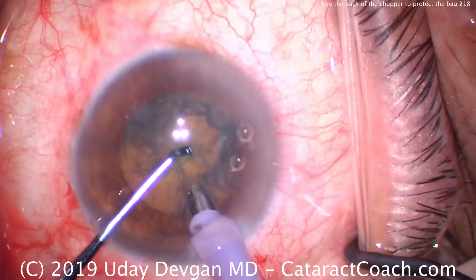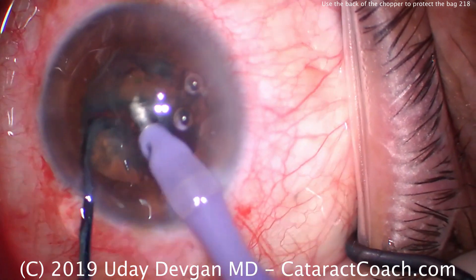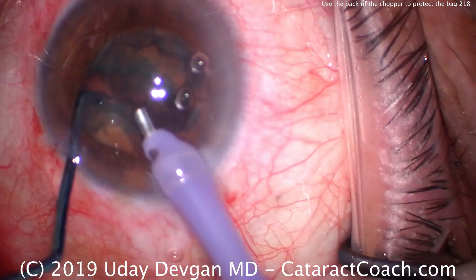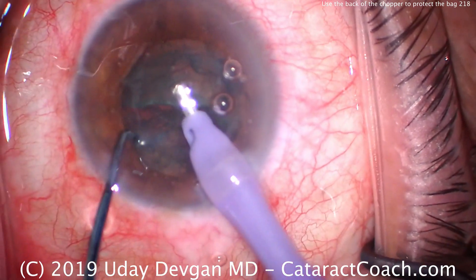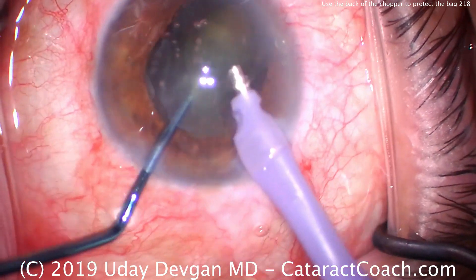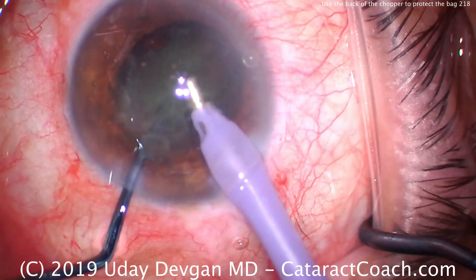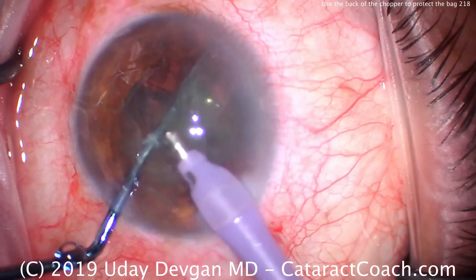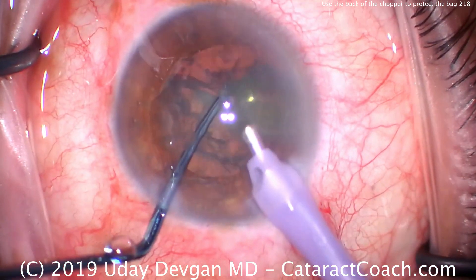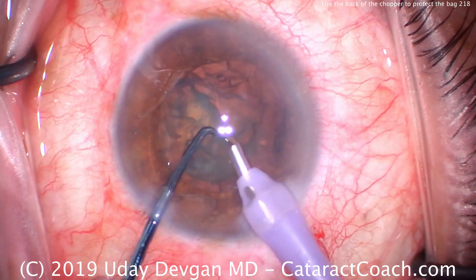We're going to buzz into the phaco probe here, put the chopper in place around the equator, and we can chop and get two halves of the nucleus. We fully separate the two halves and then bring these out of the capsular bag to emulsify them. Notice how I use the chopper to hold one piece of the nucleus — one hemi-nucleus — in the bag and out of the way, creating more of a gap, which allows me to bring that second hemi-nucleus up.